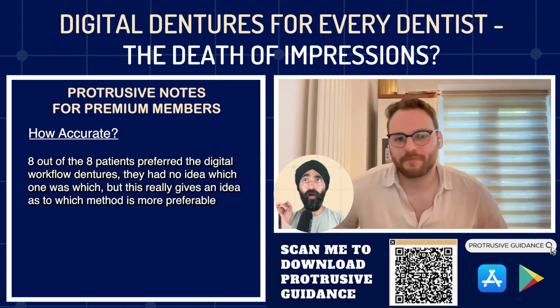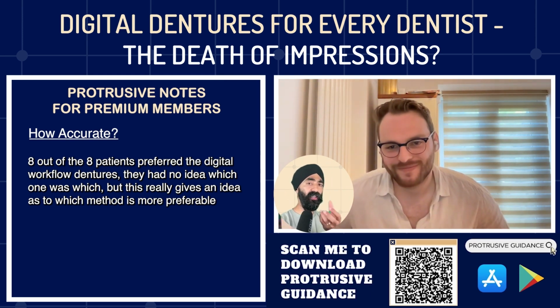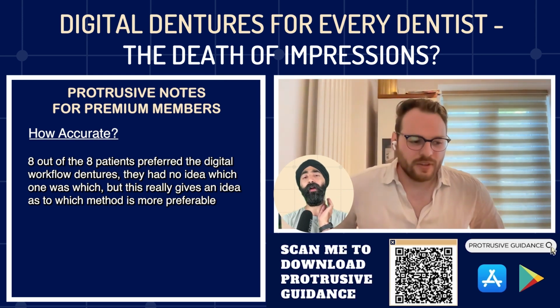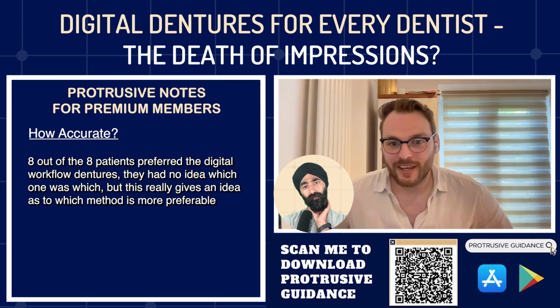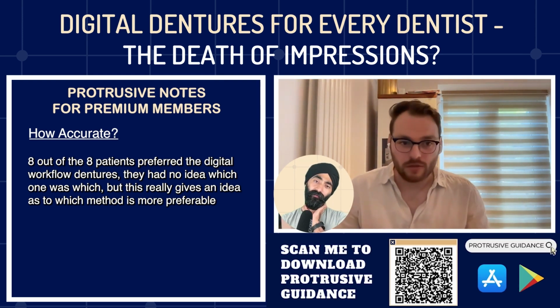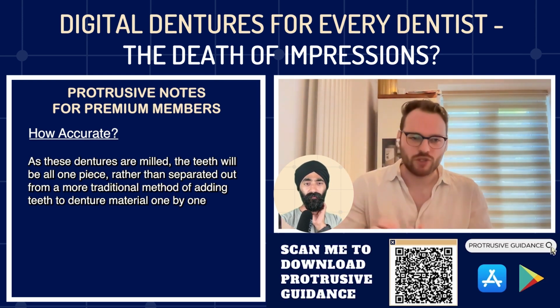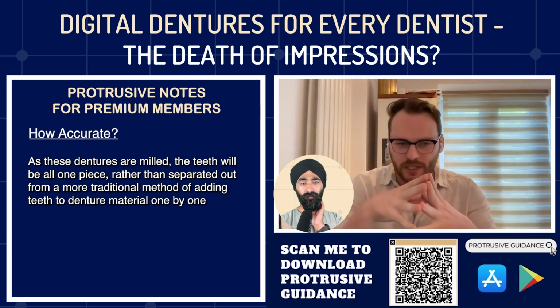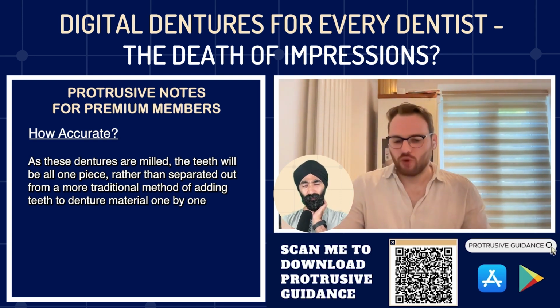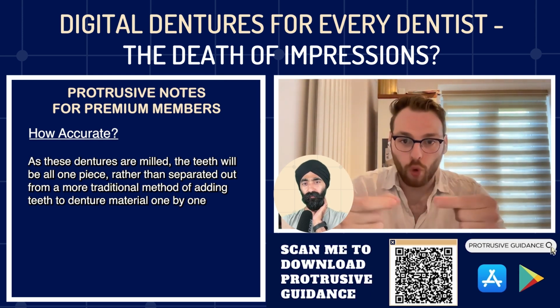That's pretty awesome. Now, when you actually look at the denture, can you tell just by looking at it which is the digital workflow, which is the impression workflow? Just about. So Dean's getting very good at disguising them. All of those cases we've done were milled complete dentures. We've done 2 different options where you mill the pink, mill the white, glue it together, and you mill the monoblock, the iVotion. So, of course, what it means is either way, the teeth are all one solid piece.